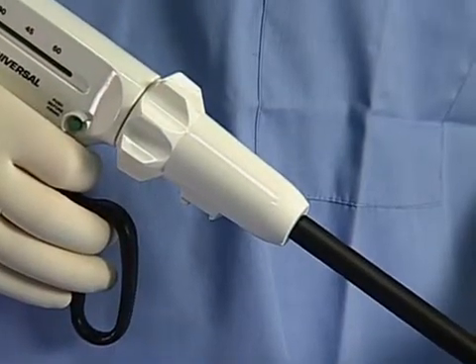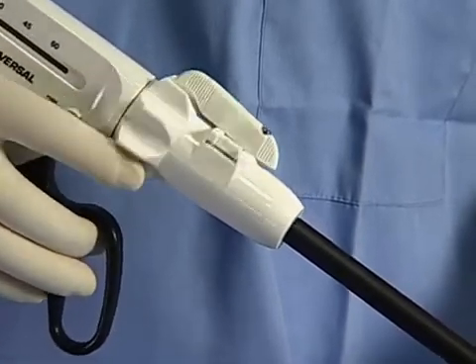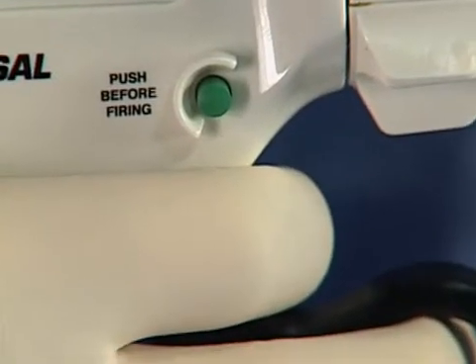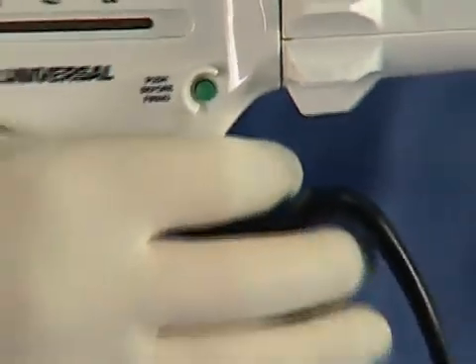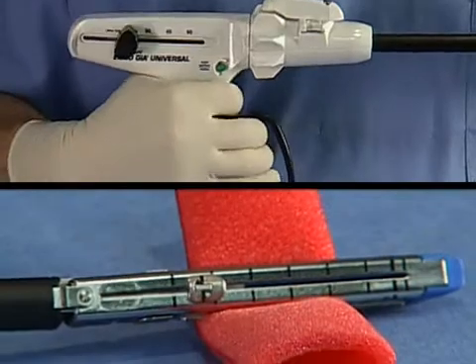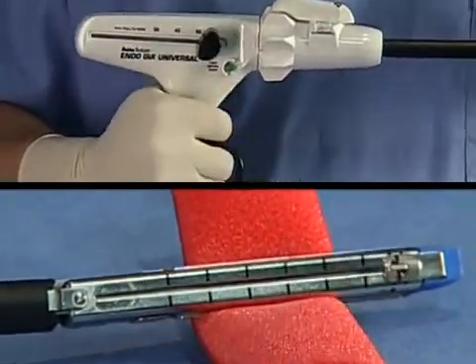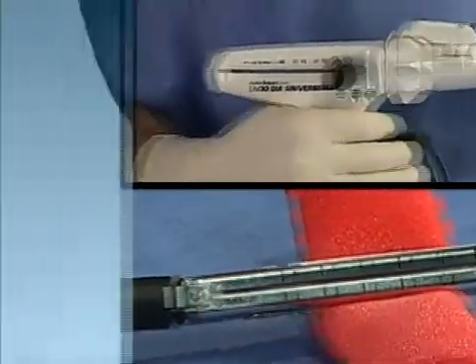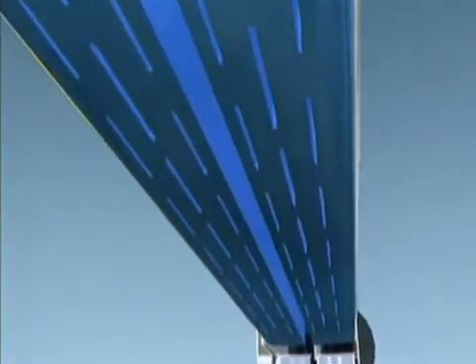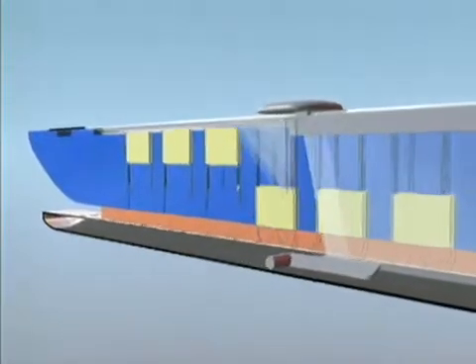The shaft of the EndoGIA Universal Stapler can also be rotated 360 degrees by using the rotating knob. When ready to fire, push the green safety button and then slowly squeeze the ring handle sequentially until the loading unit is completely fired.